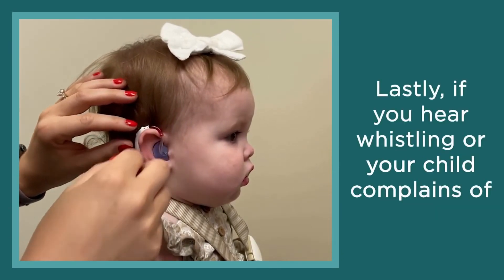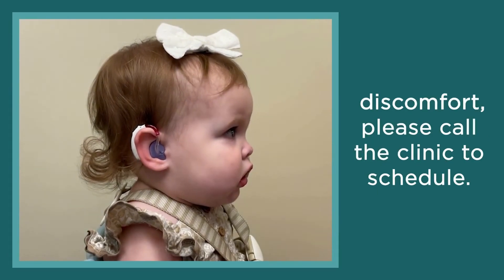Lastly, if you hear whistling or your child complains of discomfort, please call the clinic to schedule.